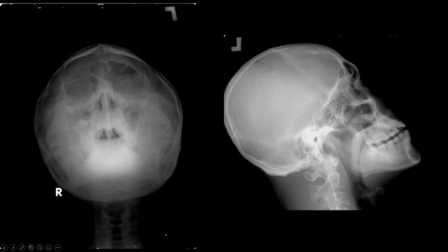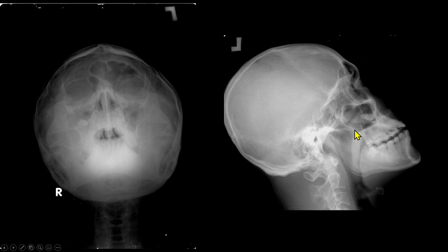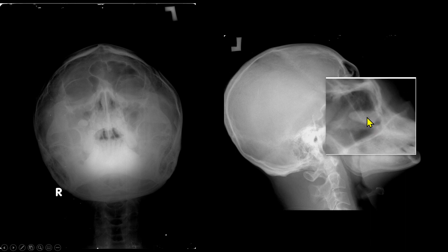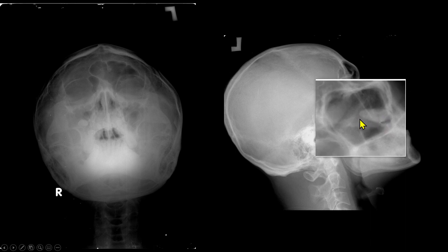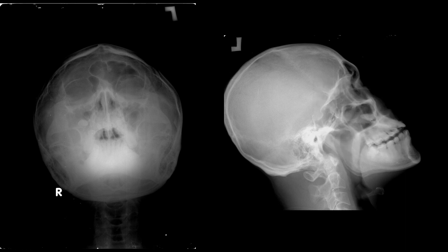I will start with the frontal and lateral view. This is the frontal view, this is the lateral view. We can see a radiopacity structure in the right maxillary sinus with radiolucency in the center. You can see radiolucency in the upper dental arch. The frontal sinus and the maxillary sinus are clear. This is suggestive of an ectopic tooth in the right maxillary sinus.